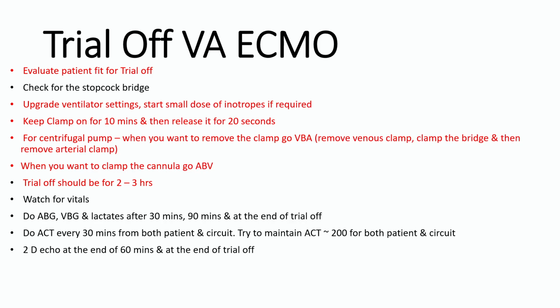So previously the heart was contracting with only 25% flow to that. Now you have to gradually keep on giving 10% flow more to the heart and see how the heart is loading, and that process is what we call the weaning process.